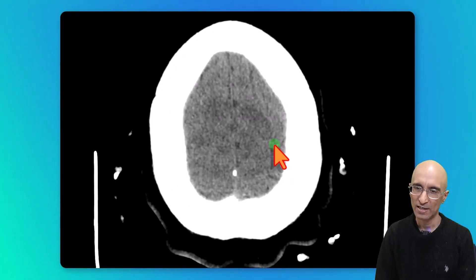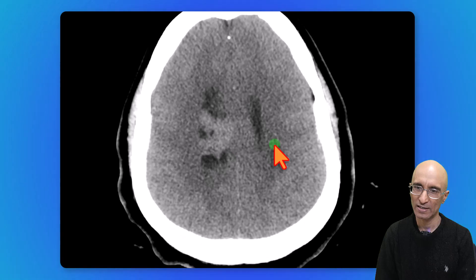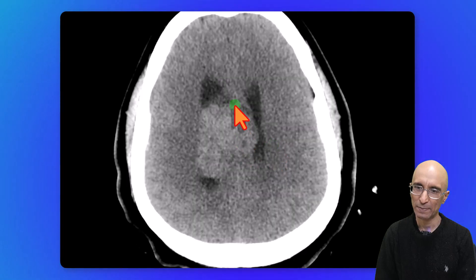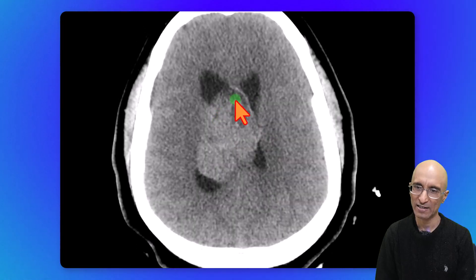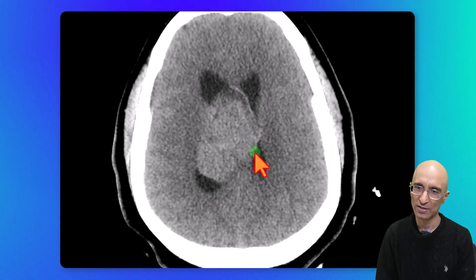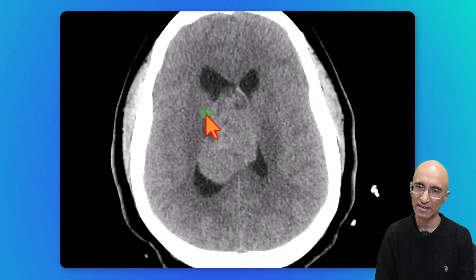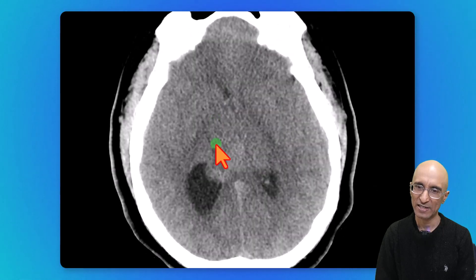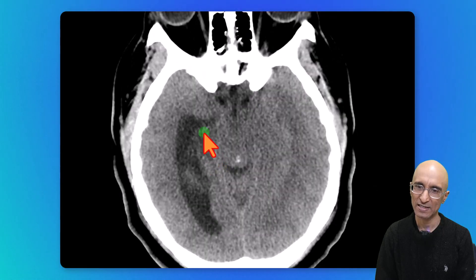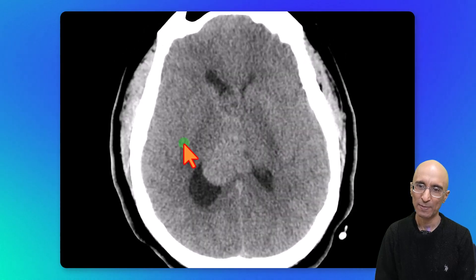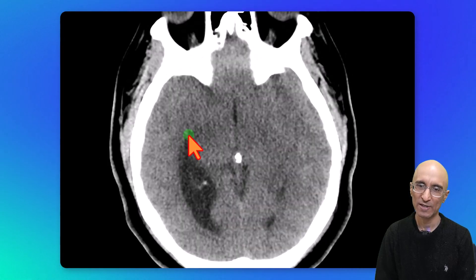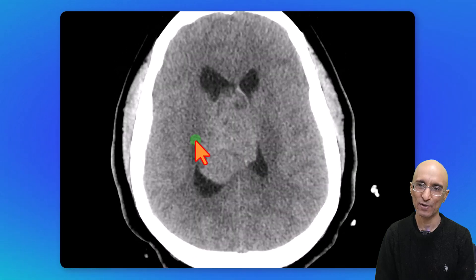On the CT head, as I scroll down, we can see a hyperdense mass within the right lateral ventricle. The lesion appears to be attached to the septum pellucidum and extends to the lateral wall of the right lateral ventricle. The right lateral ventricle is asymmetrically distended with mild periventricular hypodensity, concerning for obstructive hydrocephalus with transependymal CSF flow.